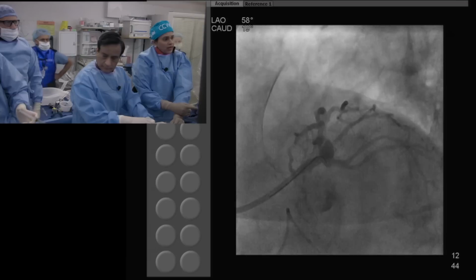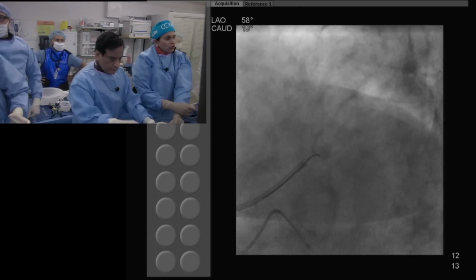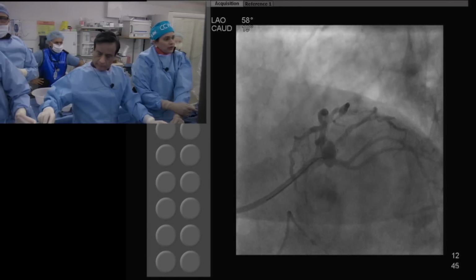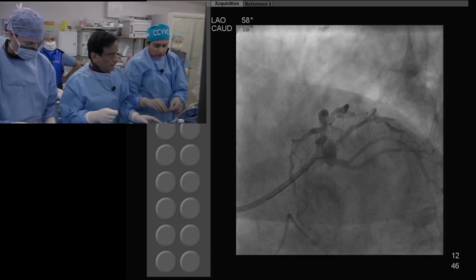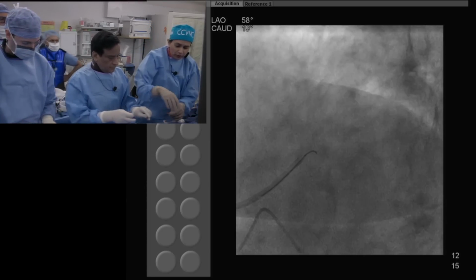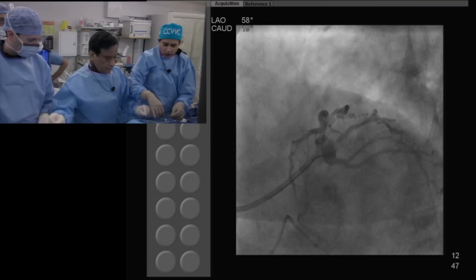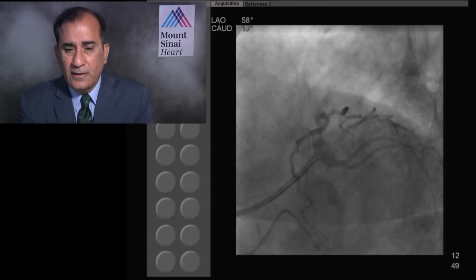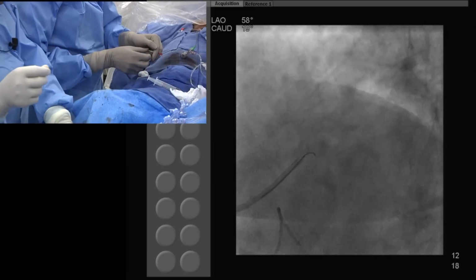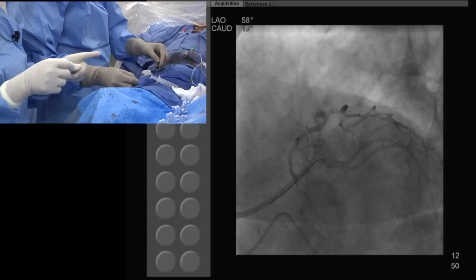So you have to enter the aneurysm and then make an acute turn. And the wire would be coiling in the aneurysm also. Yes. That is why we selected a little stiffer wire, so that you are able to make that acute turn. Samin had observed about using the Supercross too. Otherwise, if this had not helped us, it would have been a Supercross. This is the curve that crossed, if you can show it.